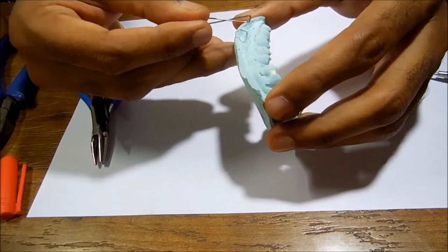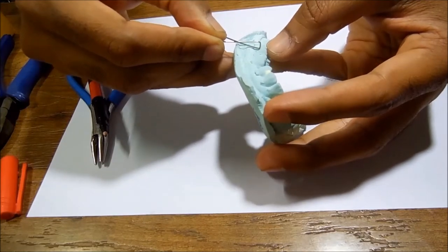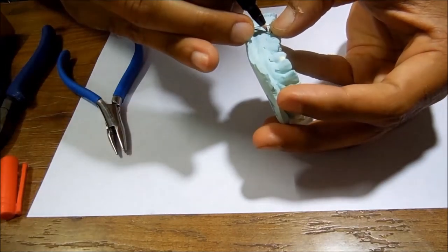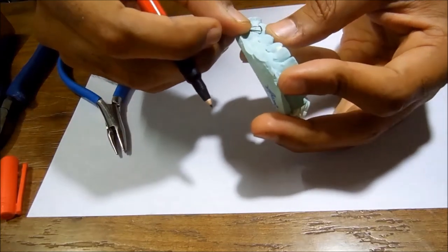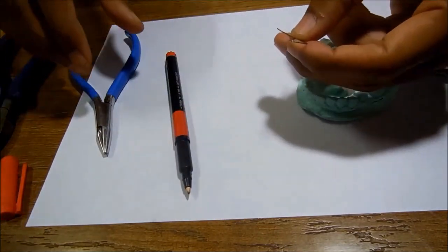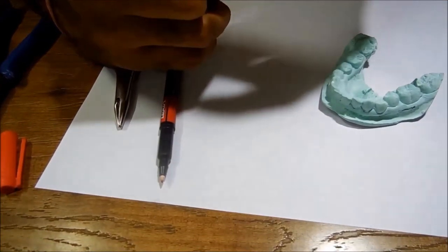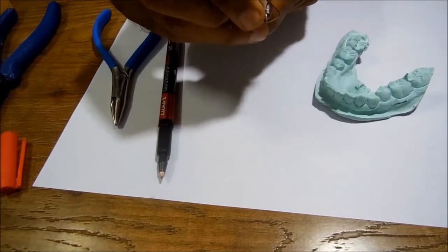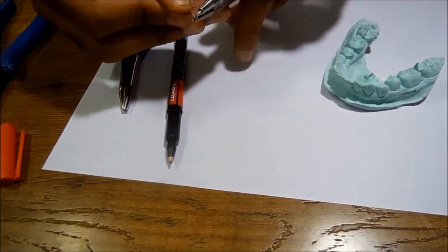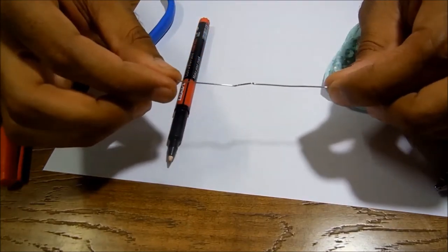Now we have to decide the height of the Adams clasp, which is roughly at one half, or let's say exactly at the half, of the cervical occlusion length. So I will be marking the length, the height of the Adams clasp, and I give a bend. This is what decides the height of my Adams clasp.